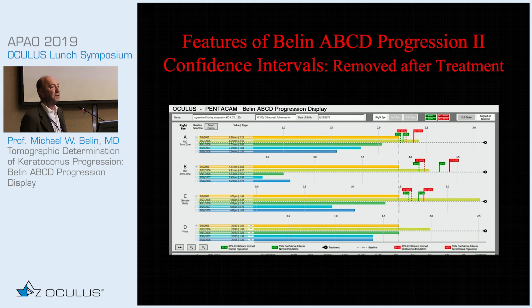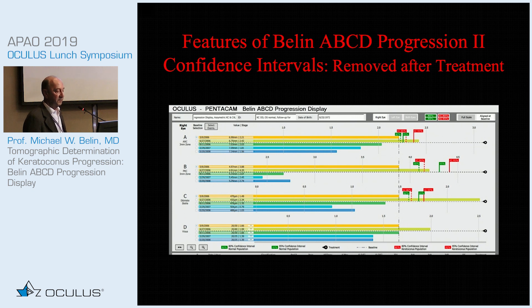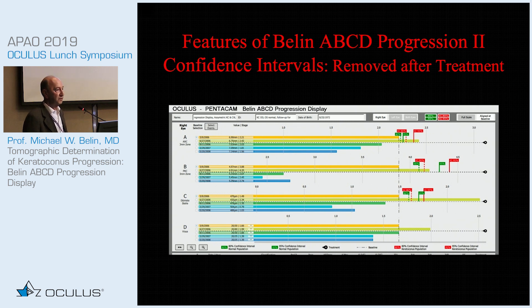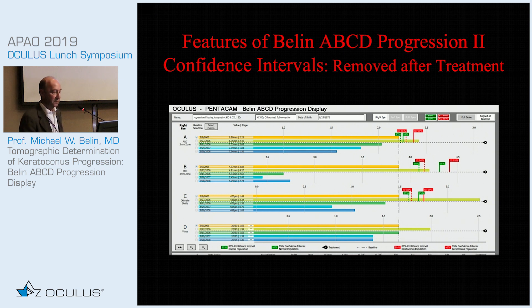One important new feature in version two: once you enter a treatment, the system eliminates the confidence intervals after that point, because the confidence intervals were determined based on normal and keratoconic populations, not a post-cross-linking patient. You signify when a treatment occurs, and there are no confidence intervals displayed below the treatment period.